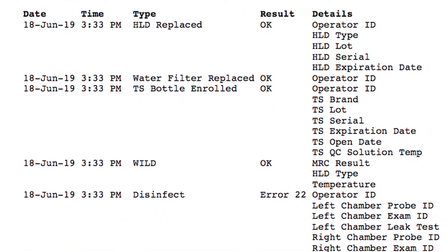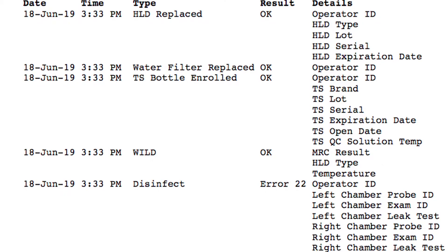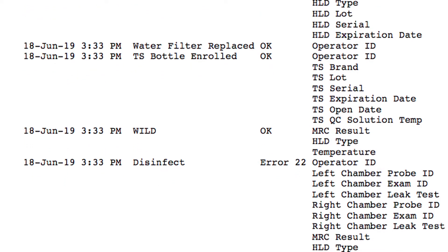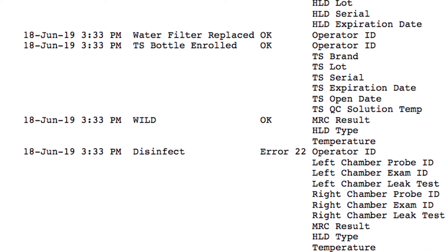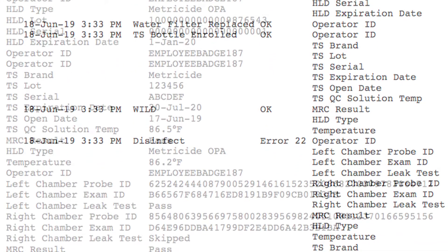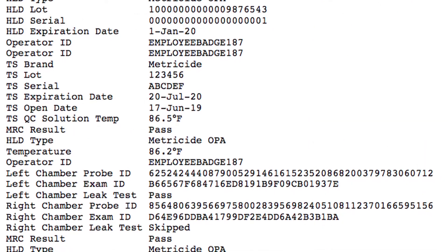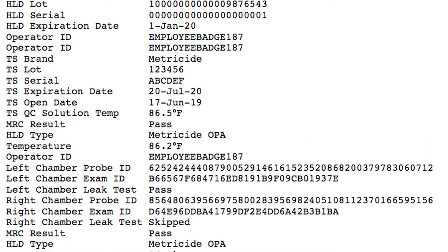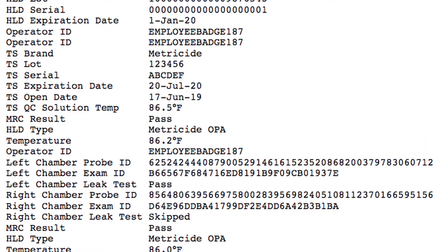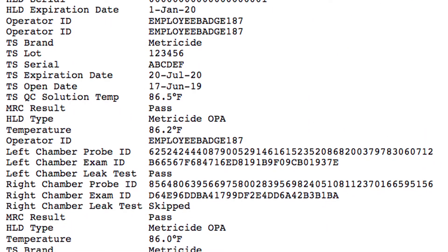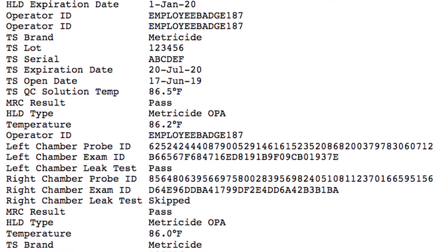The cycle log records the date and time, event — including bottle changes and filter changes — operator ID, probe ID, exam ID, second probe ID, and exam ID.